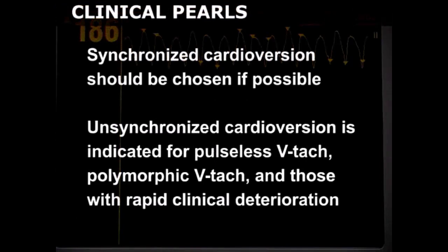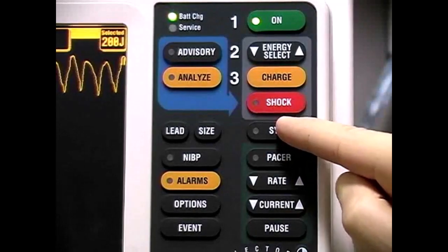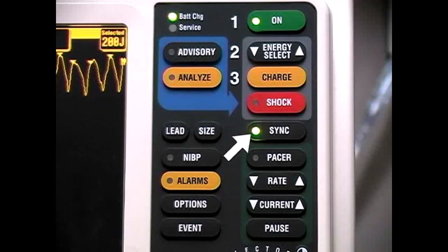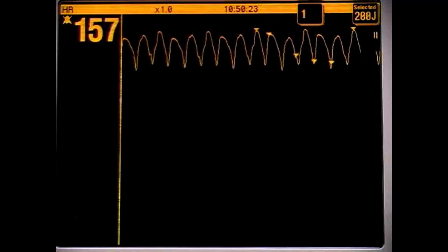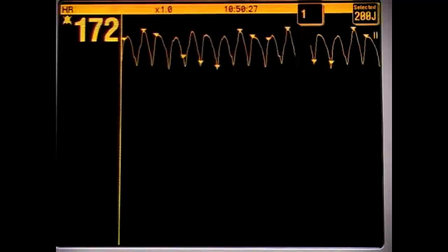Unsynchronized cardioversion is indicated for patients with pulseless ventricular tachycardia, polymorphic ventricular tachycardia, and in those with extreme and rapid deterioration of clinical status. To select synchronized mode, press the Sync button on the front panel of the monitor. An indicator light on the button signifies that synchronization is active, and the monitor will display blips on the EKG tracing to show that proper sensing of the QRS complex is occurring.